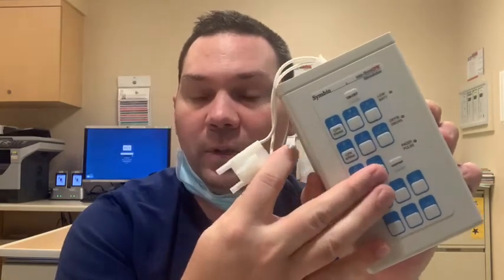So this would be in place of the defibrillator pads, and then you can push different abnormal rhythms and take a look at what they look like on the Zoll Defibrillator. I'll go over basic functions such as the monitoring function, different shockable rhythms, and pacing. Lastly, I'll show you how to print the test log to make sure a test was completed.